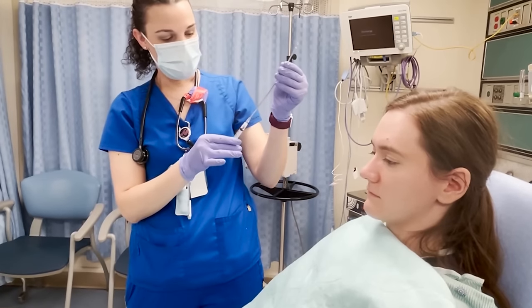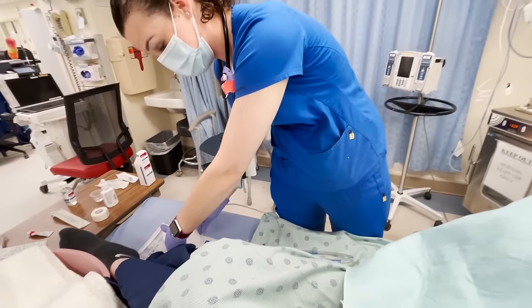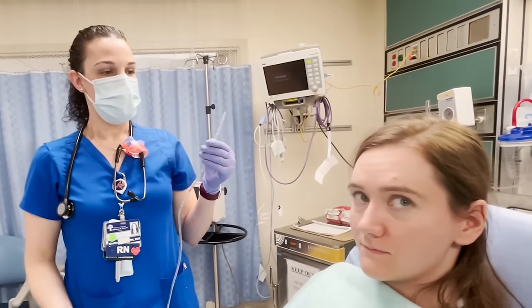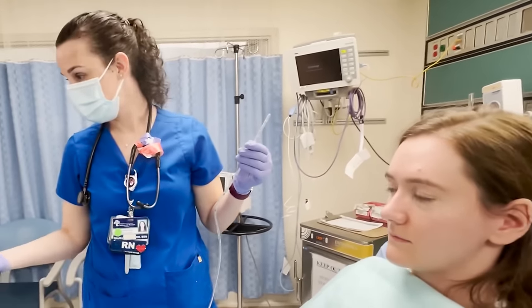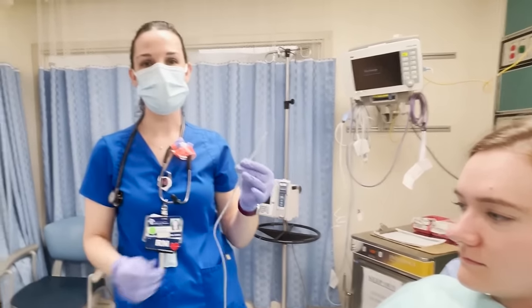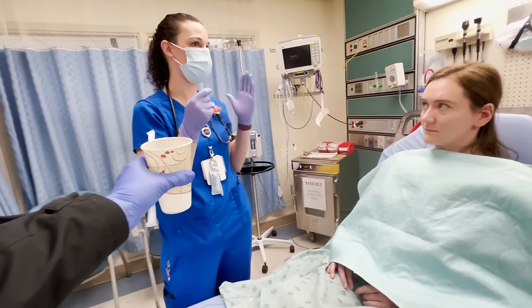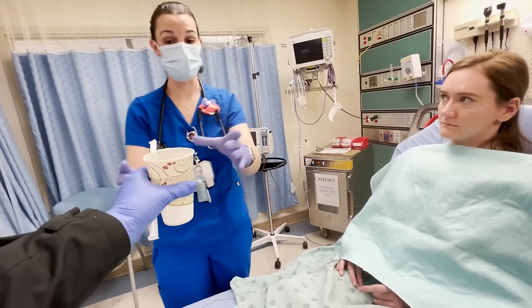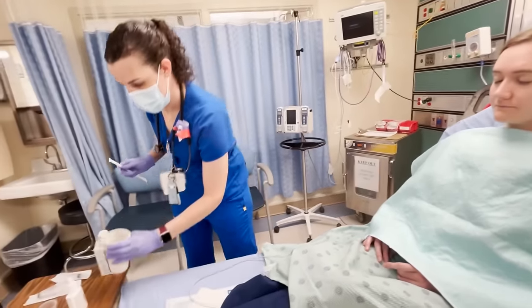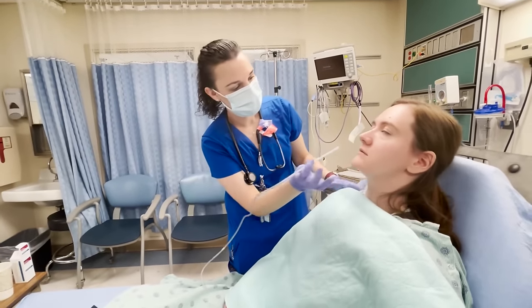It's right at half a ml. The important thing is you don't go up — you go straight back. We also have a cup of water. When we get to the back of your throat, we're going to change your position from leaning back to leaning forward, and that's when we'll have you start swallowing. Okay, you ready? Just relax your head back.